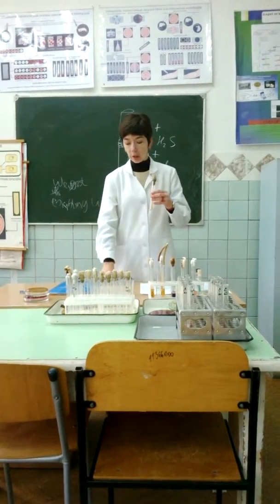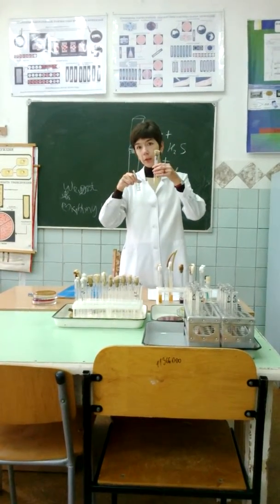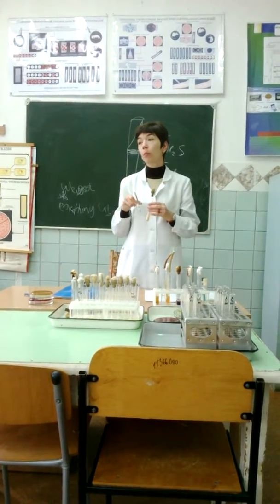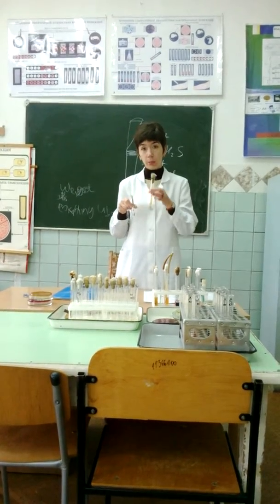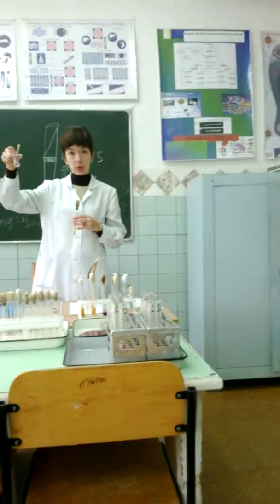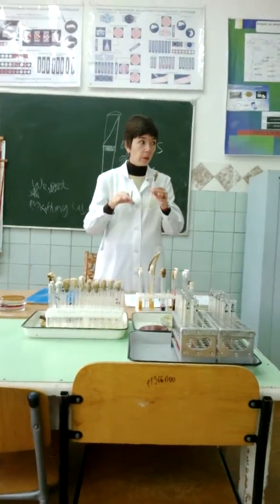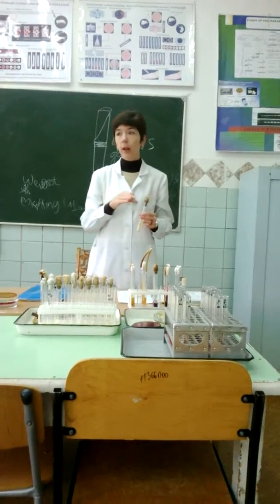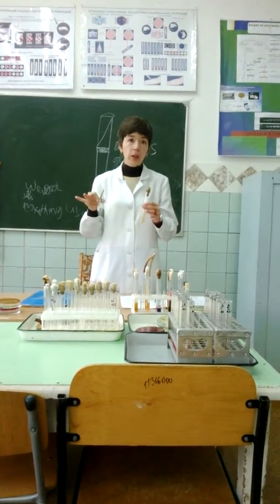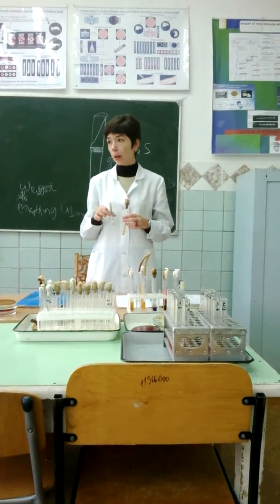If these antigens are present in the bacteria, this antibody clumps the bacteria, and you obtain a positive reaction. Clumping means that these antigens are present. If antigens are absent, the bacteria spread very well, with turbidity of the drops but no white clumps.